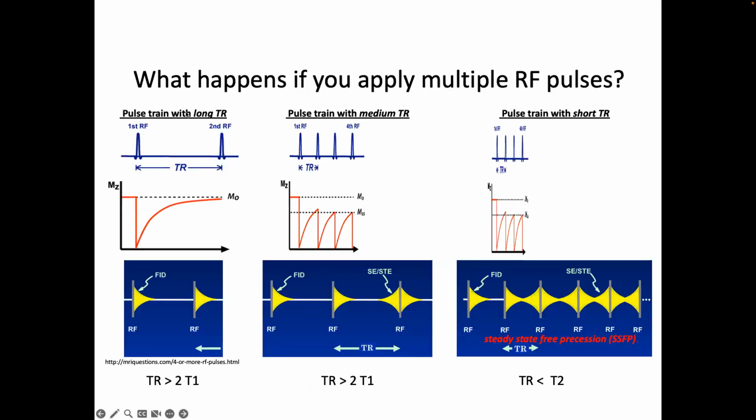This basically gives you some instinct as to how this works out. And that is, if I do an RF pulse here, by T1, if after this pulse there is no MZ, or no magnetization left, I take it all and put it in the transverse plane. Remember, the T1 recovery curve looks like this. The time to get all the way back to here is on the order of seconds, right? So these two RF pulses have to be seconds apart, or 5.